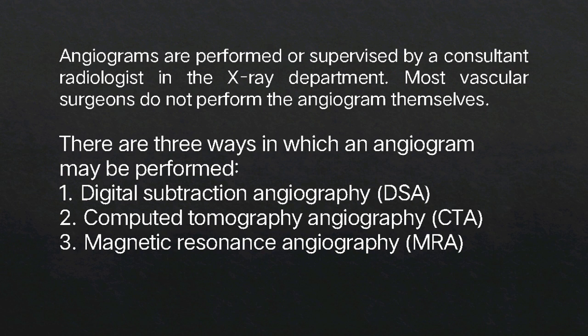There are three ways in which an angiogram may be performed. First, the digital subtraction angiography or DSA. Second, computed tomography angiography or CTA. And lastly, the magnetic resonance angiography or MRA.